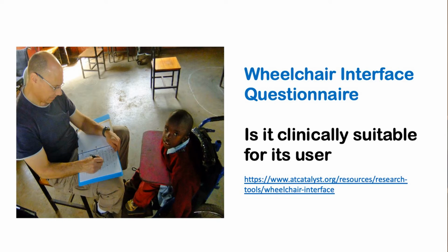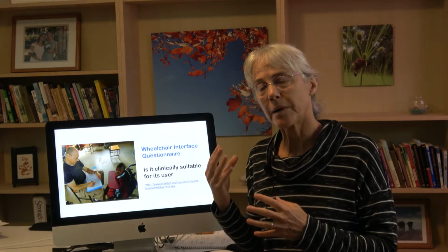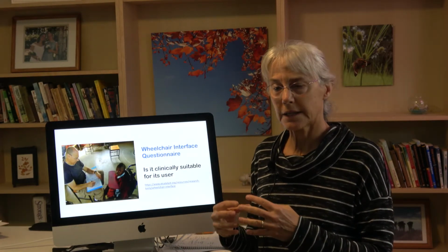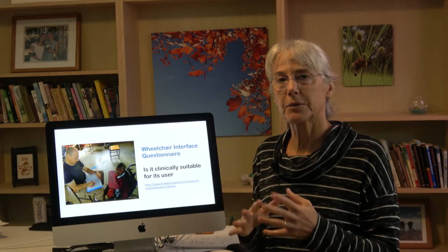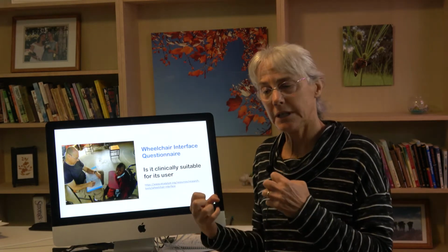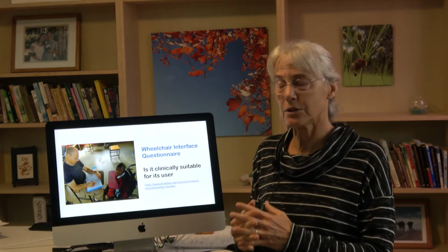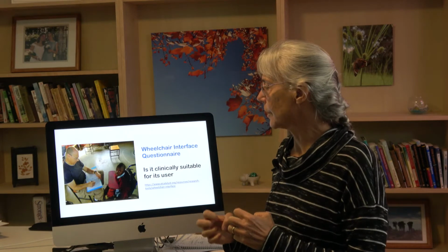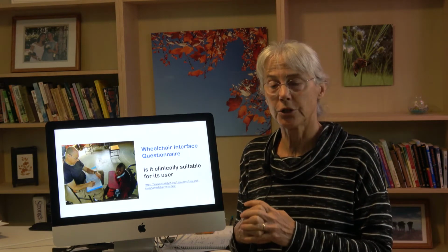Okay, the next measure I'd like to tell you about is the Wheelchair Interface Questionnaire. This is the one that I think is probably the most useful in collecting large data sets on wheelchair function. And it's one of the ones that we struggled the most to refine and make the right format to be really useful. It's answering the question, is this wheelchair clinically suitable for its user?